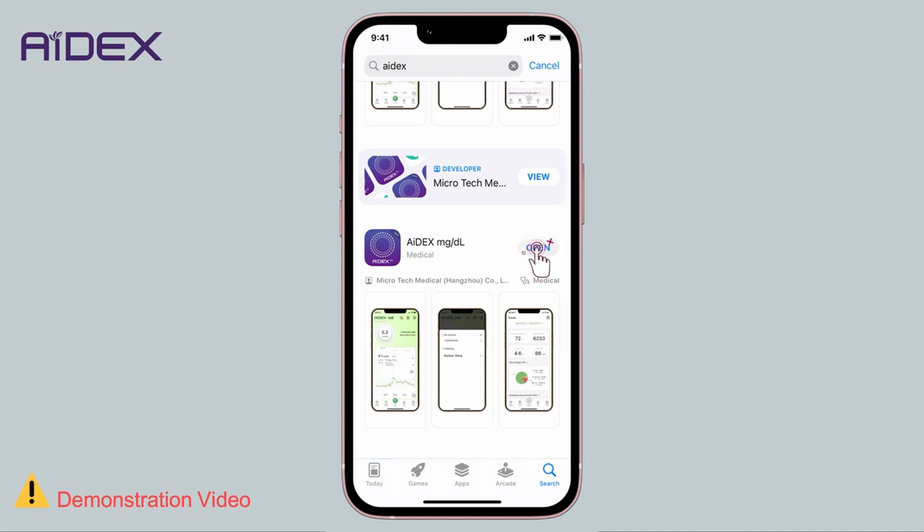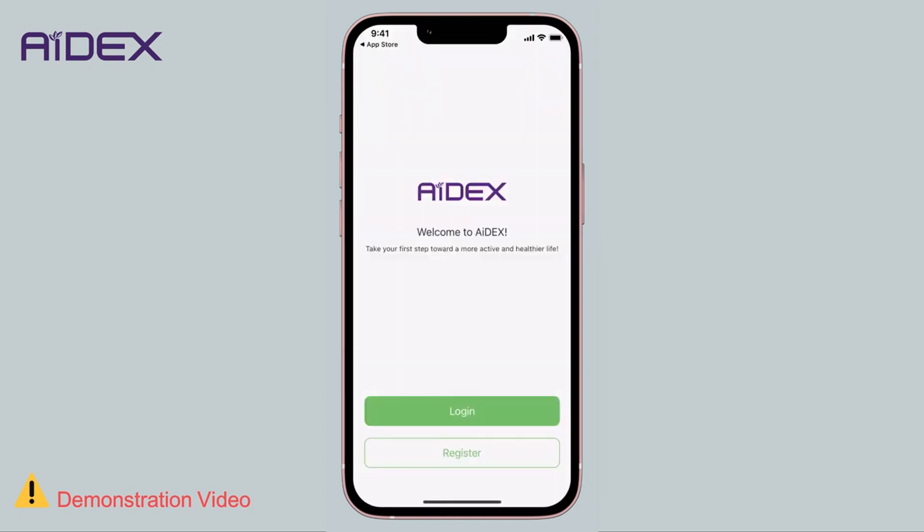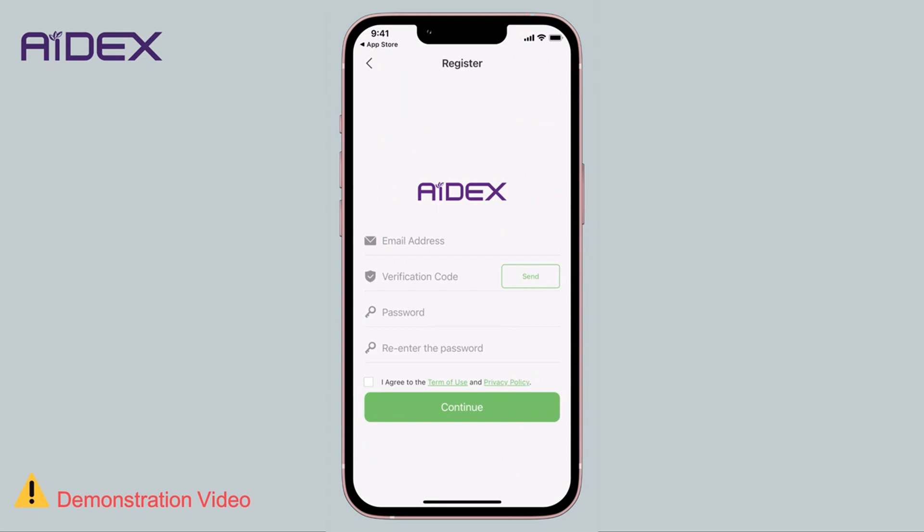If you are using the application for the first time, you will need to create an account. Make sure you have an active email address to use. Enter your email address. Choose a password — it must be at least 8 characters long, including at least one uppercase letter, one lowercase letter, and one number.